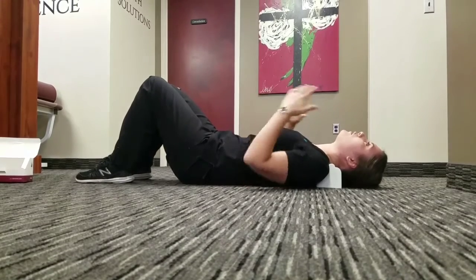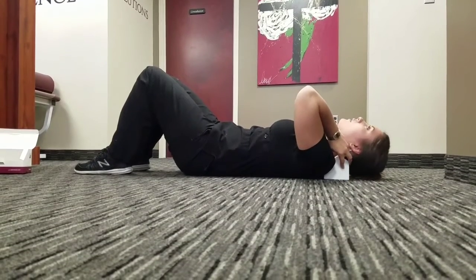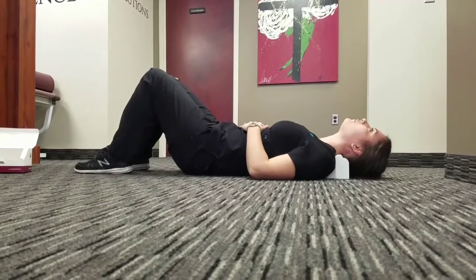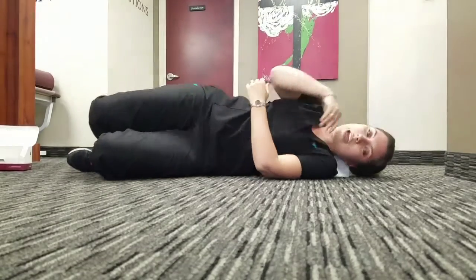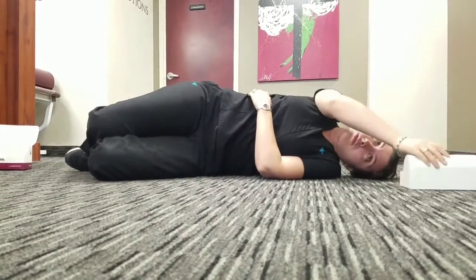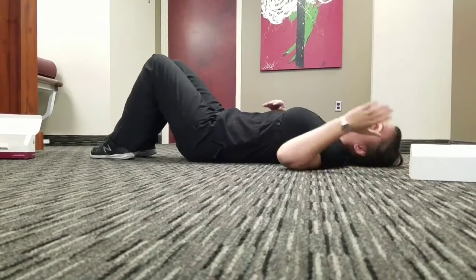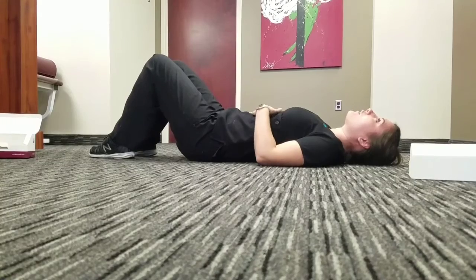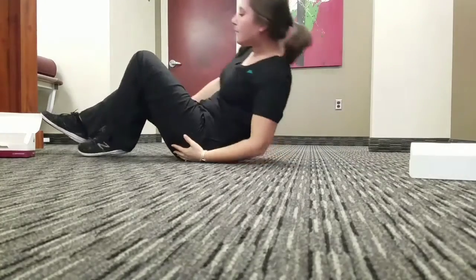If you're going to do the upper neck, your neck would be placed here, just like this. Again, after 30 seconds, you would roll to your side, pull the pillow out, roll back to your back. So after you pull this out, you're going to lay back onto your back for 30 seconds. After you've been there for 30 seconds, you're just going to sit up, and you're done.